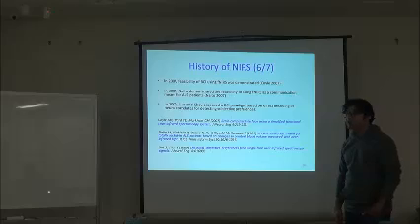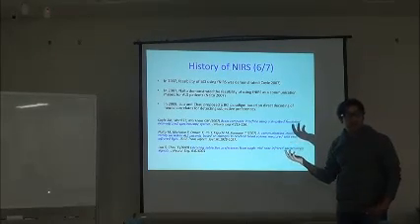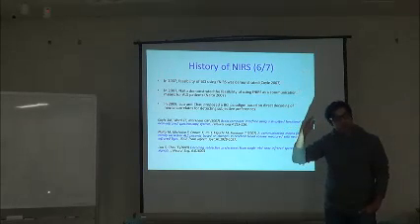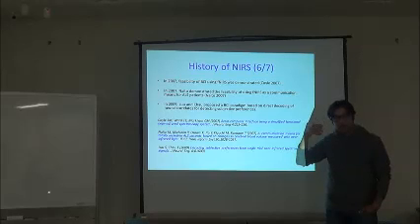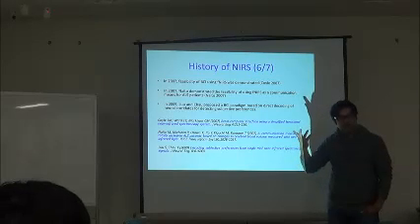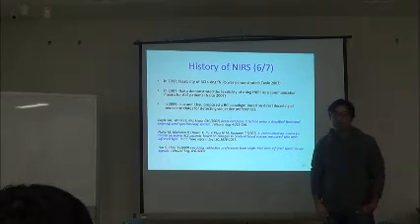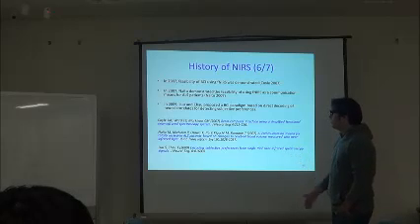He conducted the experiments using different activities like imagination of slow music and imagination of soft sceneries, and he classified them against the imagination and mental rehearsal of fast music to give a two-state communication tool, as in, you can say, on and off, or yes or no.